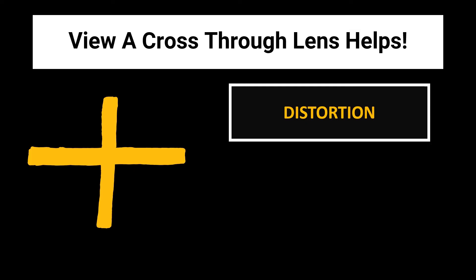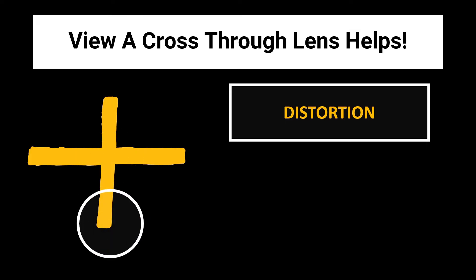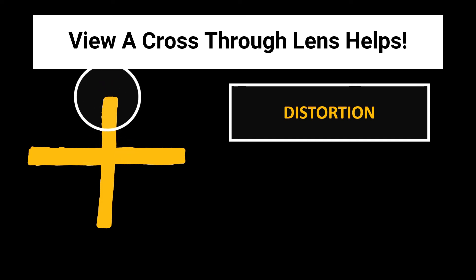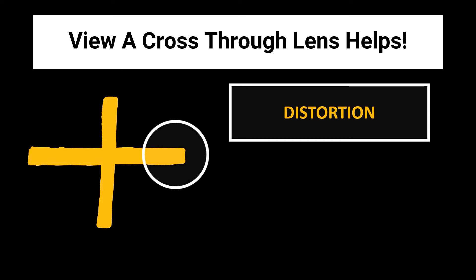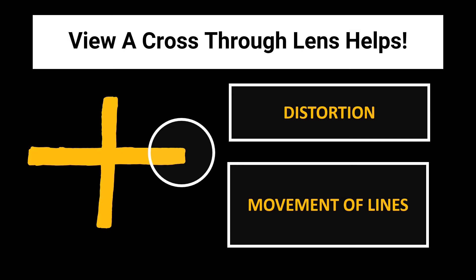Place the lens and look for distortion of the image. Then move the lens in various directions across the cross. As you move the lens, observe in which direction the image of the cross moves. Based on that movement, you can identify the type of lens.